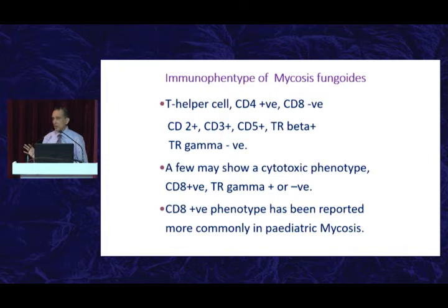But then why do we do it? Sometimes we may not be sure whether the cells in the epidermis are actually lymphocytes or whether they are squamous cells with pyknotic nuclei, in which case you can do a CD3 stain. Okay? Now, for routine diagnosis, it's not necessary to do CD4 and CD8 stains, but I will come back to that later on.